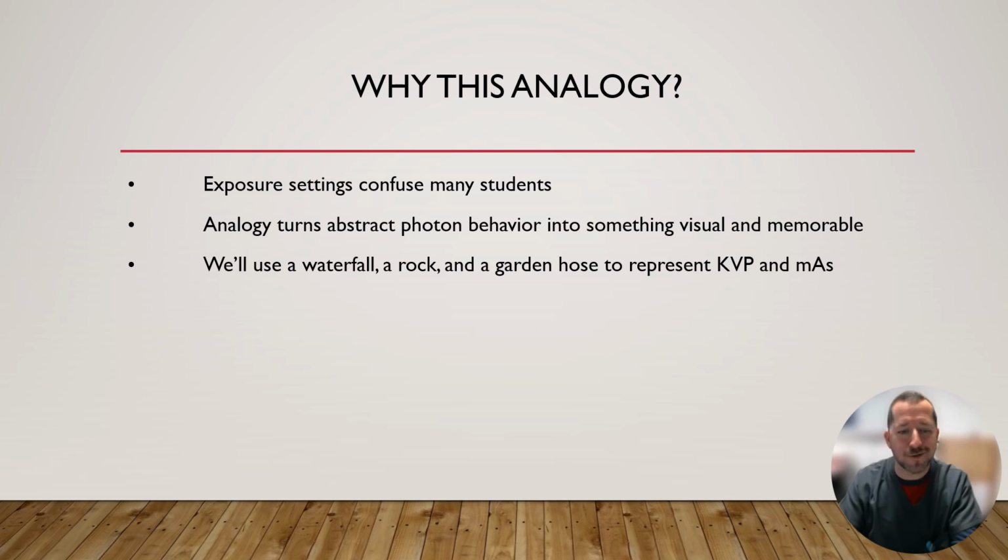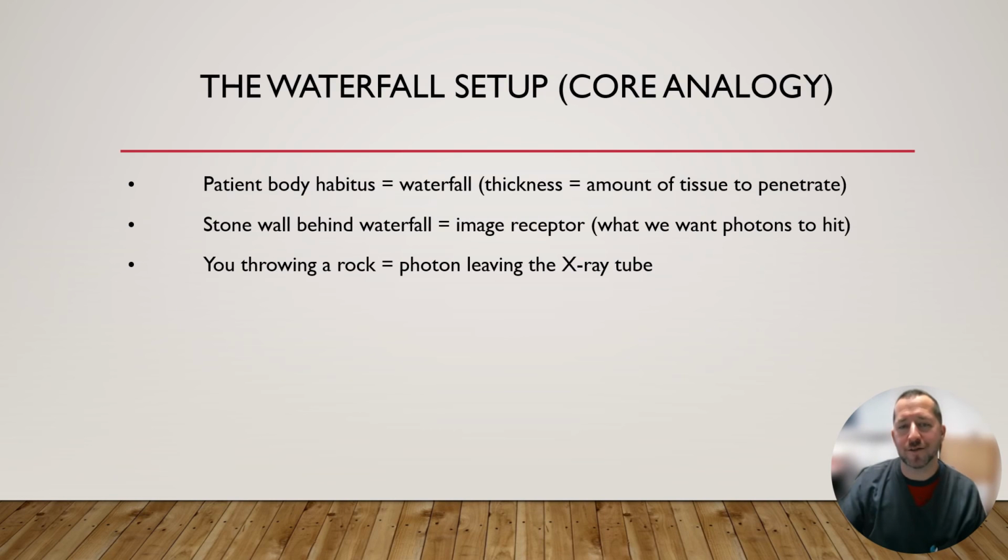This analogy turns the abstract photon behavior and kind of hearing it in physics terms and puts it into a more layman presentation. So again, a waterfall, which can designate body habitus, a rock, which is going to designate our photons, or MAS, leaving the tube.